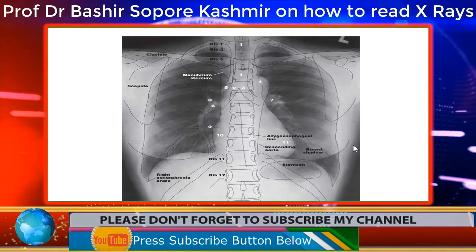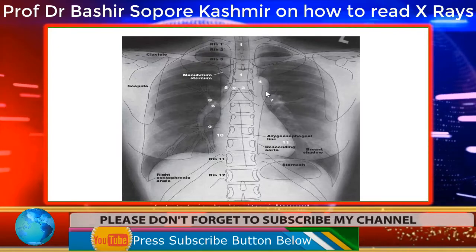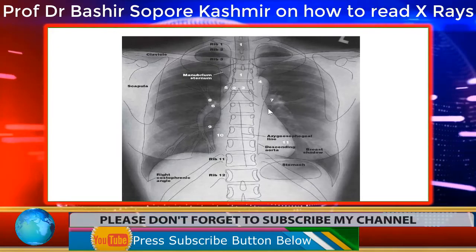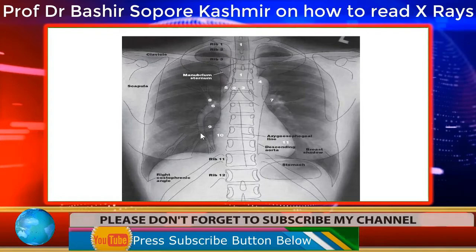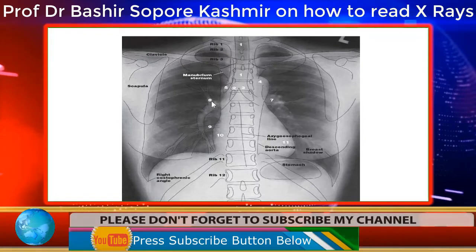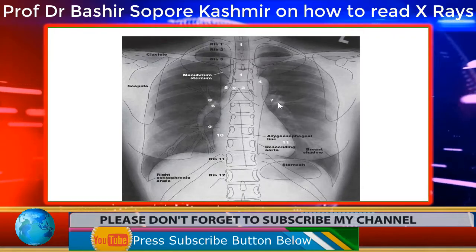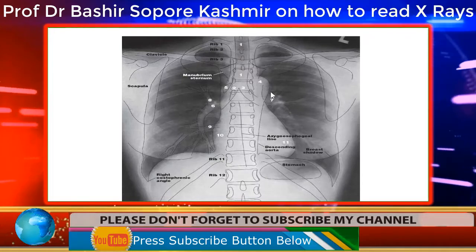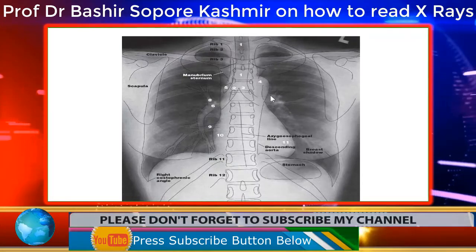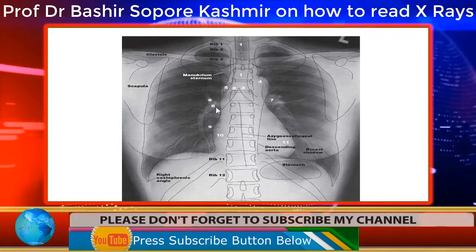Now, if we look at this image, this is the aortic knuckle and this is the pulmonary artery. Here you can see the pulmonary artery, one goes down to the lower lobe, the other goes to the upper lobe. Similarly here, it goes up and it goes down. So it forms a V shape. You can see this is the V shape, right? And this is the hila or hilum of the left lung and hilum of the right lung.